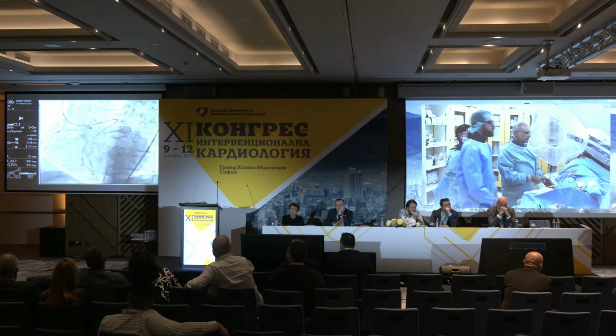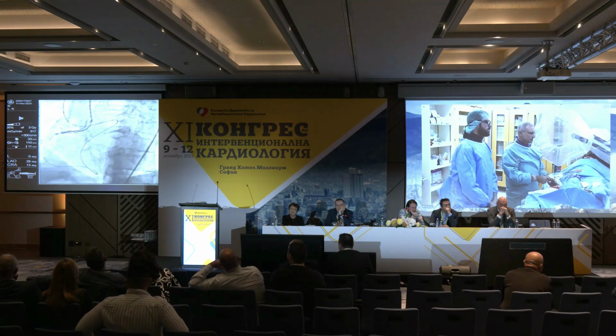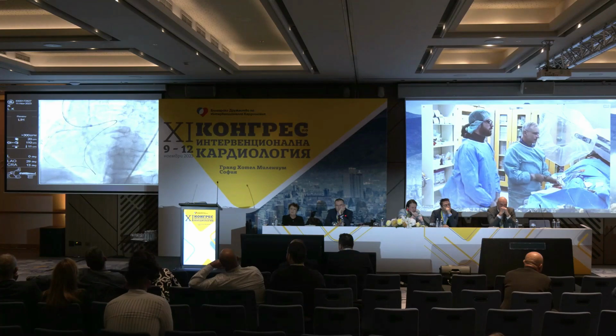Let's see a little bit here. Simply the vessel is too big. Look, where is the microcatheter?